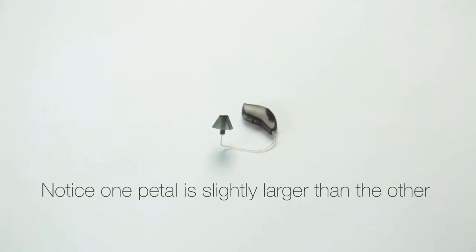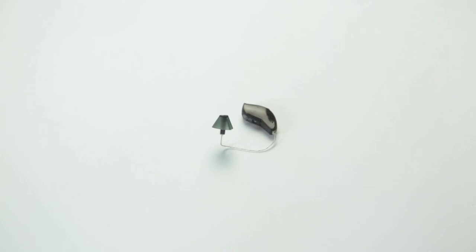Notice one petal is slightly larger than the other. If needed, adjust the tulip dome petals so that the largest petal covers the smaller one. This ensures the most comfortable fit when wearing your hearing aids.